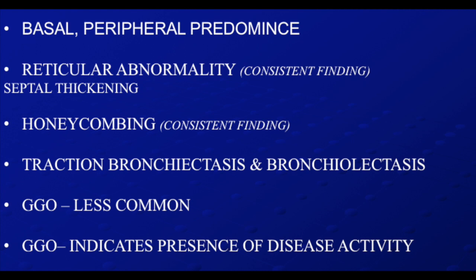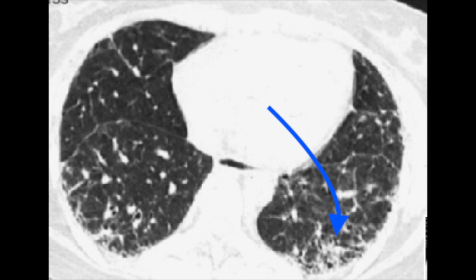In a known case of IPF showing all signs of irreversibility, if you see ground glass opacity, that means there is an exacerbation and acute alveolitis in a chronic case. This is inter- and intralobular septal thickening. There is subtle bronchiectasis and bronchiolectasis. As the bronchi go peripheral they converge — you have no business seeing such big bronchi in the periphery. This is traction bronchiectasis.